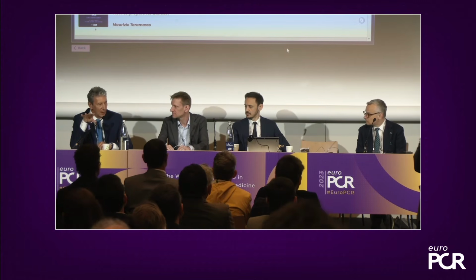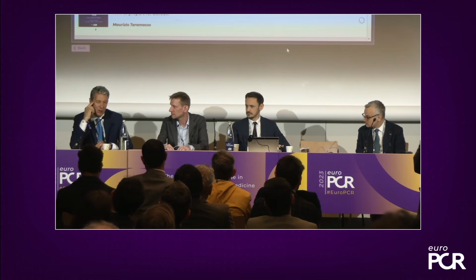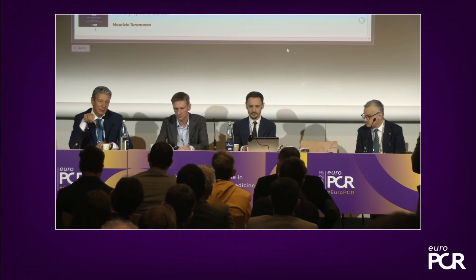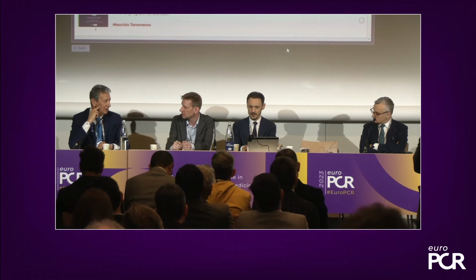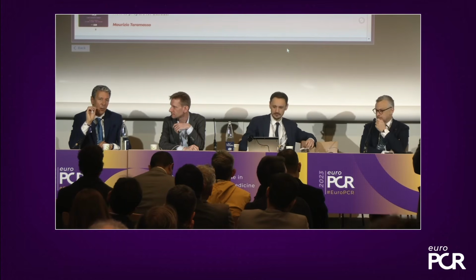Francesco, if you exclude with the echo that there is a problem at the vessel, we inject a small amount of adrenaline diluted 1 to 10, 1 cc, for the small subcutaneous bleeding. Yeah, it's really effective. We do that too, but that's if you think it's the tract. You want it coming from the tract, the ooze, and then you give adrenaline with lidocaine mix. Yes, exactly. But the first step is to check that there are no problems at the vessel.